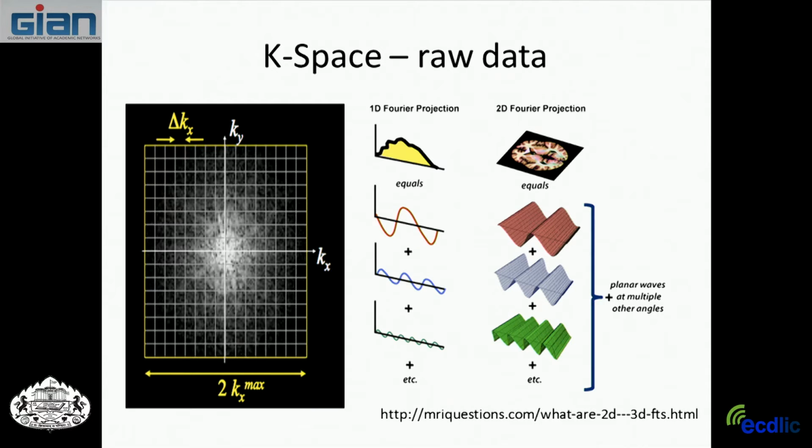Now we're doing this in 2 dimensions, so we're trying to fit, again, sine and cosine waves to make 2-dimensional images. And instead of these looking like a time signal, now we can look down from 3 dimensions, and what it looks like basically is stripes of black and white. So we can use the stripe information by putting different weights to the different frequencies and the different intensities. And this is what makes the picture of the image here.